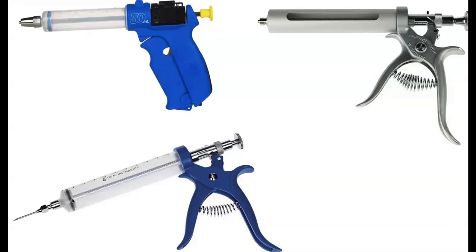It actually has the O-ring you have to compress. So the plunger here, you actually can turn that on the back there and that will compress that O-ring. If you don't get that done exactly right, you can have some leakages in those situations, so be aware of that. The other thing with this Ideal and this Hapner is the adjustment's a little bit different. So you can see this one has a turning wheel like the two on the previous slide did. These actually have 5 little grooves and you kind of have a little pin that you move into whatever groove. So it kind of comes down to personal preference as far as which one you want to go with.